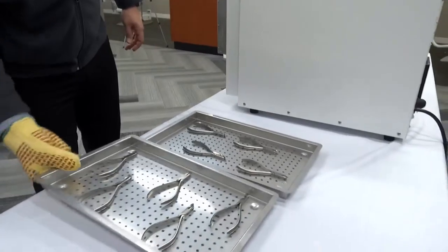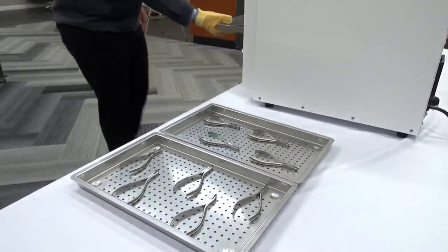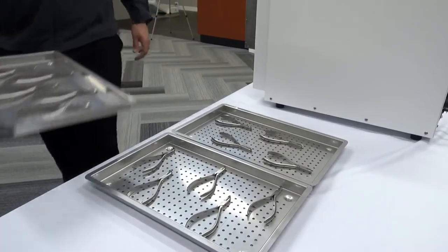Once the unit is in operation, it is 100% going to lock the door so nobody can come in and unlock it and create an issue or a hazard.